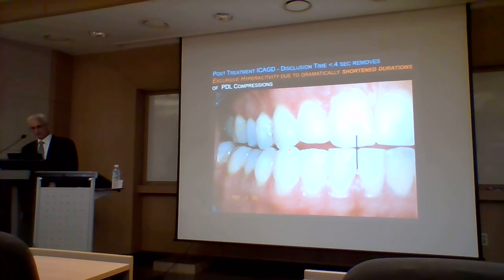So here she has more space, although she still has premolar contact, and it appears that she discludes better when she moves to the right. 아까 봤던 거 기억나시는지 모르겠는데 6번에 굉장히 근접해 있고 컨택이 있던 걸 다 없애줬죠.